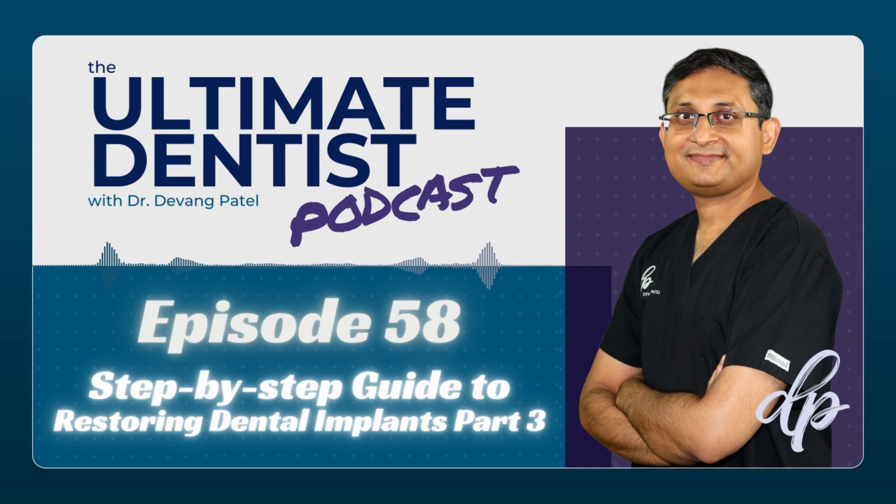If they're cementing the crown, it's like imagining you have a very short tooth and you're making a crown on top. You're probably not very confident that the crown will last, because the forces which some patients can apply can break the bond between the crown and the cement. This is exactly what can happen if technicians use small Ti bases. So this works fine if the technician is using a custom abutment or milling the Ti bases themselves with a taller abutment height, so that when the crown is cemented, it's well supported.